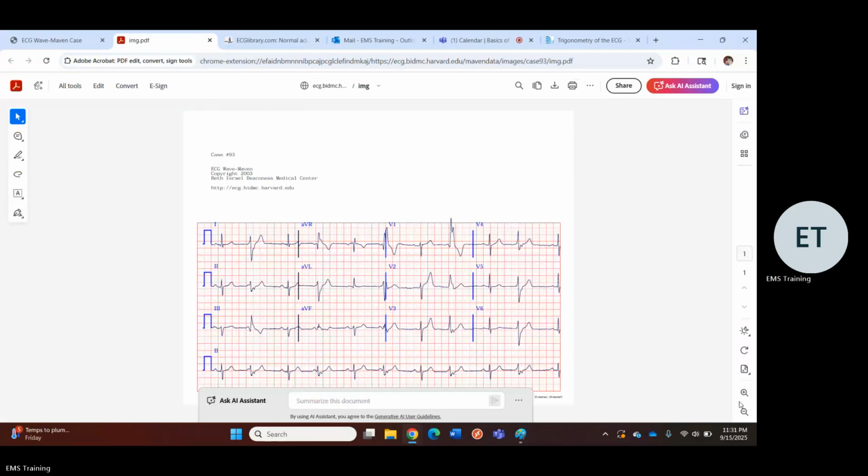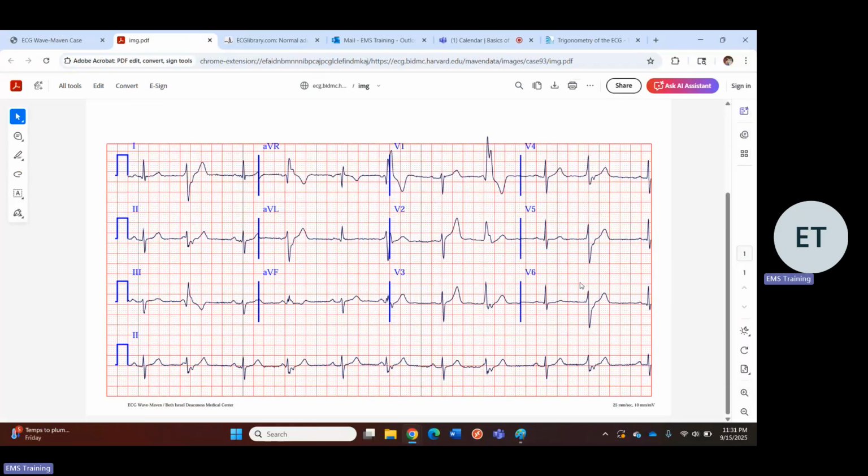Whoa. Right away. Does not look normal. P waves. I don't know. Is that a P wave? An inverted retrograde P wave? Tell you what, there's a delta wave though. But only with the PVCs. Interesting. These PVCs almost meet Sgarbossa criteria. Anyways, back on track. Whoa, this is tough.